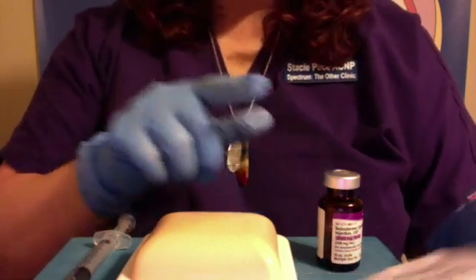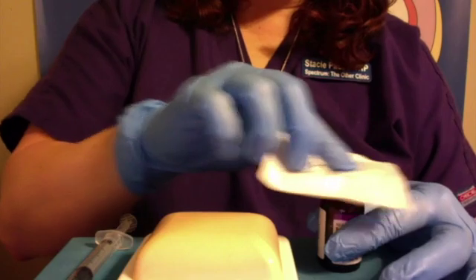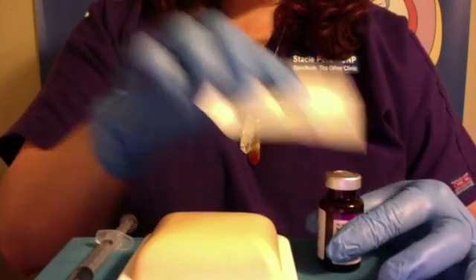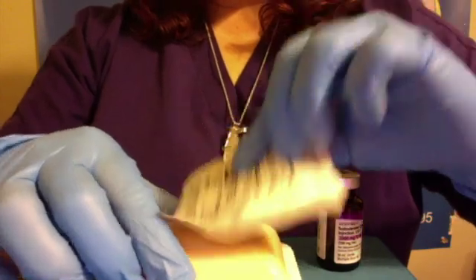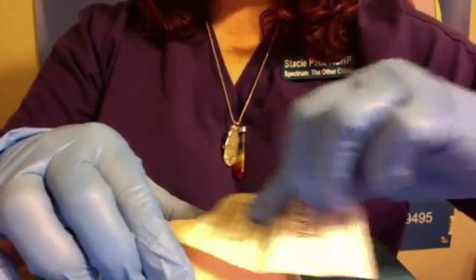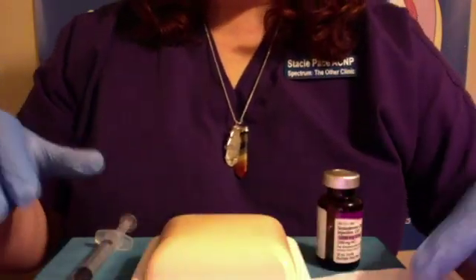Next, I'm going to make sure the top of the vial is sterilized. I take my alcohol wipe and wipe in a circular fashion for 10 seconds across the top to make sure it is sterile — we don't want to be putting any bacteria into our vial. Then I'm going to take the same alcohol wipe, get my injection site, and wipe it in a circular fashion for about 10 seconds as well. Then I'll set the alcohol wipe to the side.